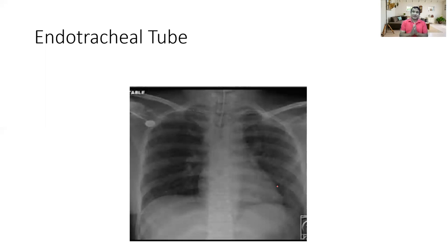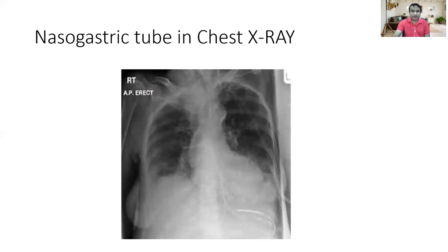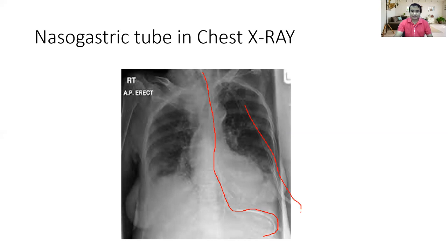After knowing the technicalities, you have to look for tubes and artifacts. In this case X-ray, you can see a radio-opacity — this is the endotracheal tube. You can also see chest electrodes. If you see thin line shadows, these are probably CVP lines. If you follow another tube, you can trace a nasogastric tube. There is also another tube visible here — this is probably the tube for the oxygen mask. These are the things you need to identify before proceeding with interpretation.